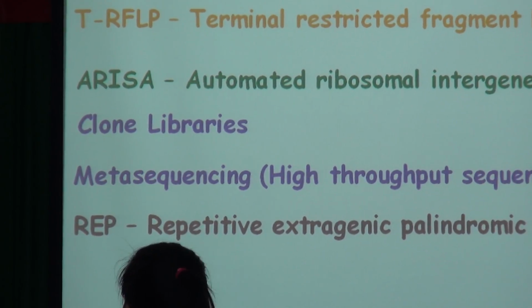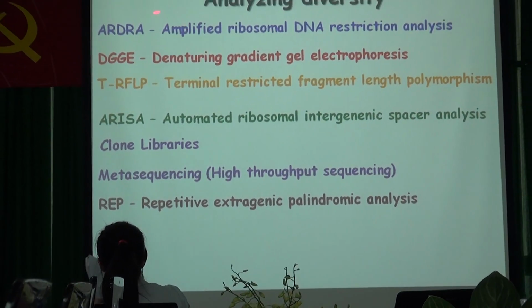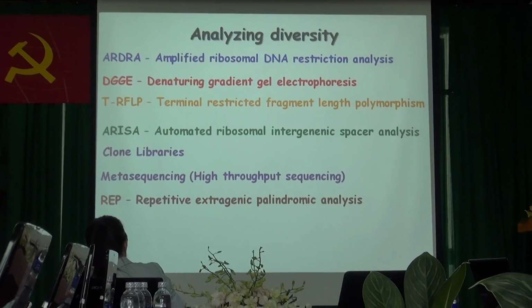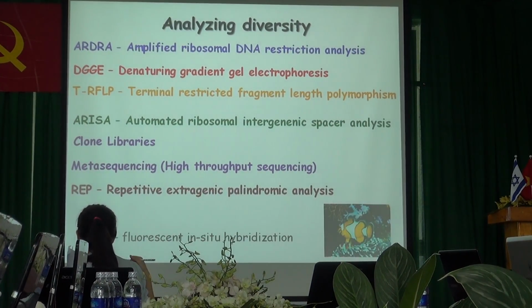Okay? This one actually is not based on direct DNA extraction. This one is based on colony analysis. So we're not going to talk about this one.